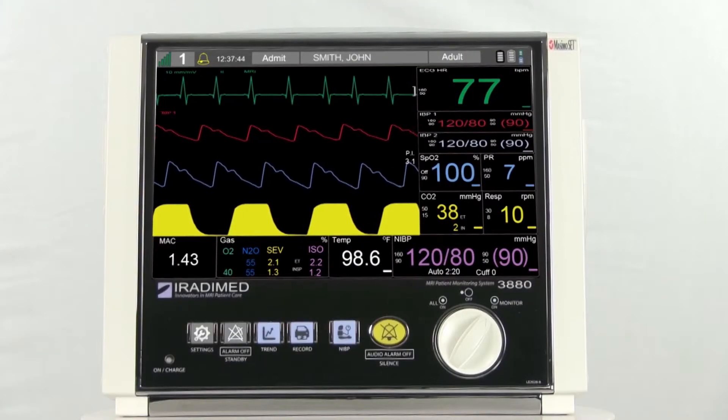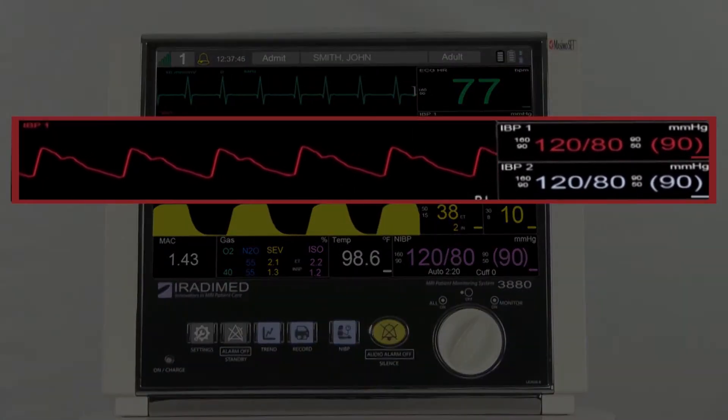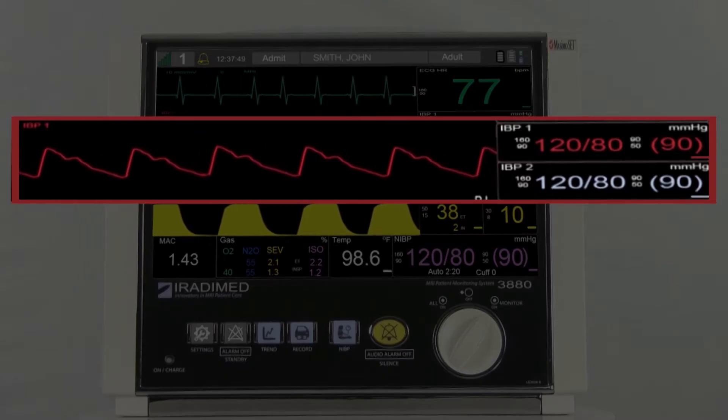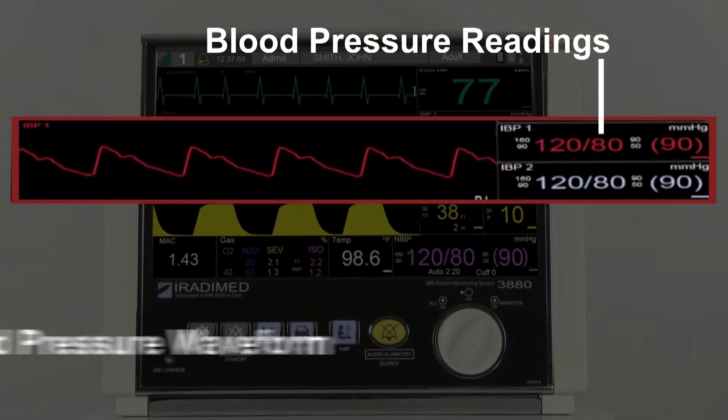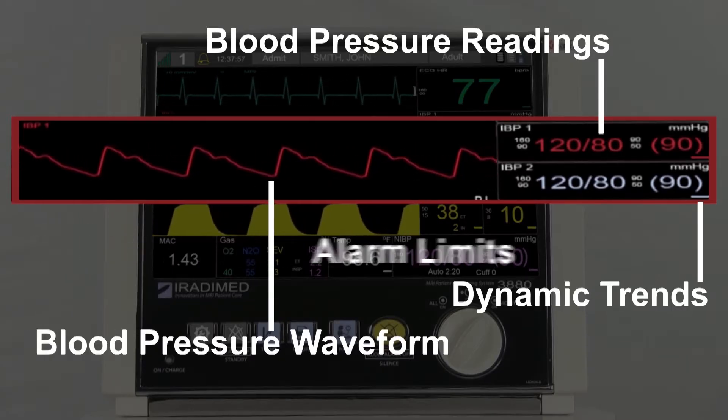The invasive blood pressure readings will be displayed in the various color-coded sections below the ECG section on the patient monitor. Here, the user will see the blood pressure readings, the blood pressure waveform, dynamic trends, and alarm limits.